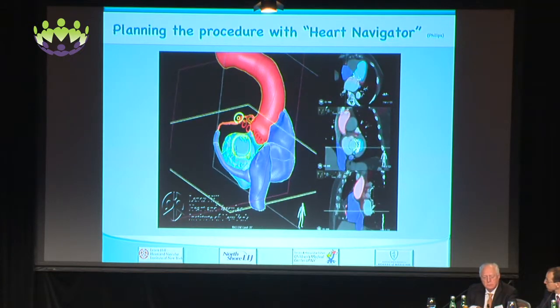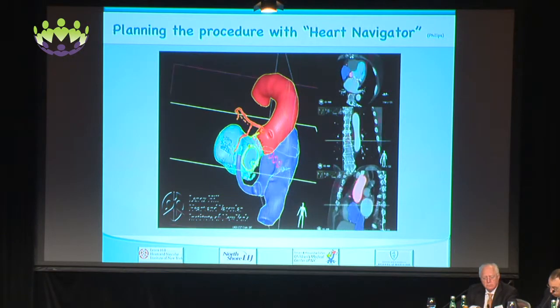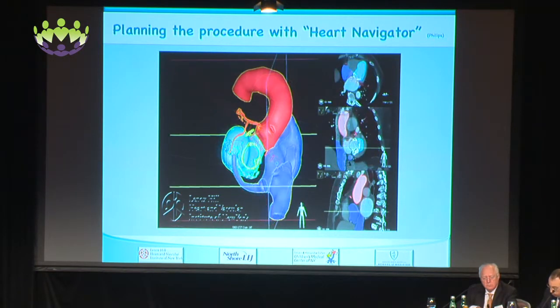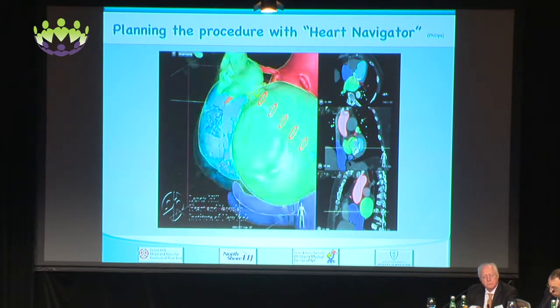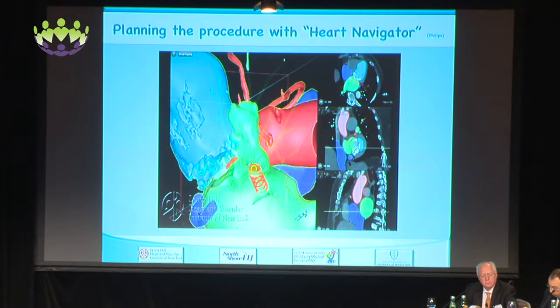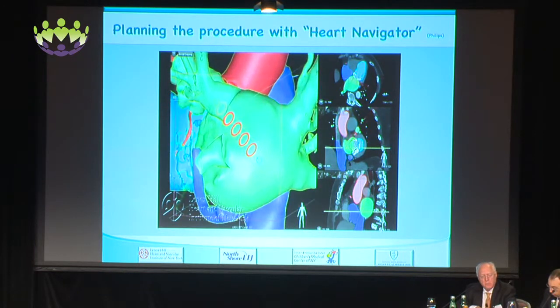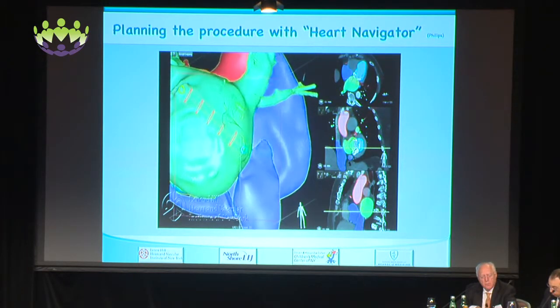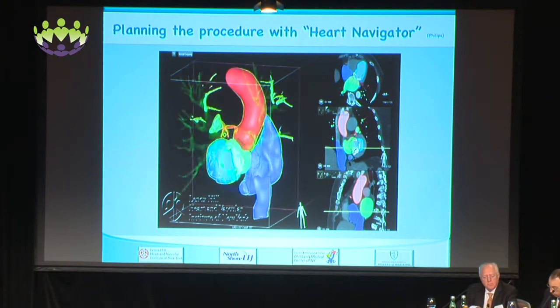Using the pre-acquired CT on those patients, we plan those interventions very carefully. And you saw from Dr. Wunderlich's talk how important, for example, the transeptal access point is. There is no reason to guess. We can play on these images and find the more coaxial point, not only to the orifice of the appendage, but to the entire main body of the entry of the left atrial appendage.